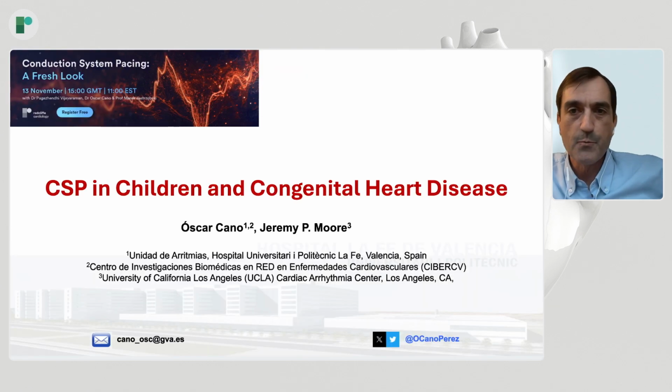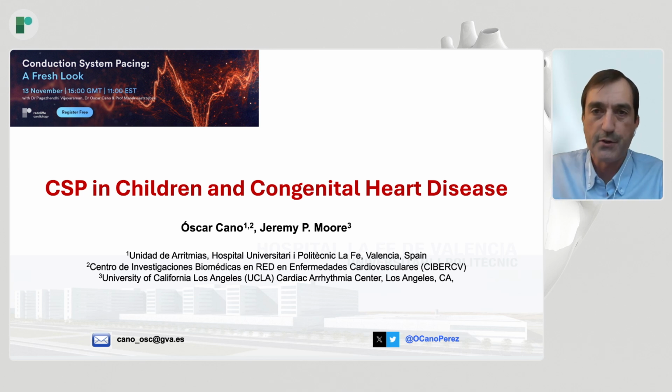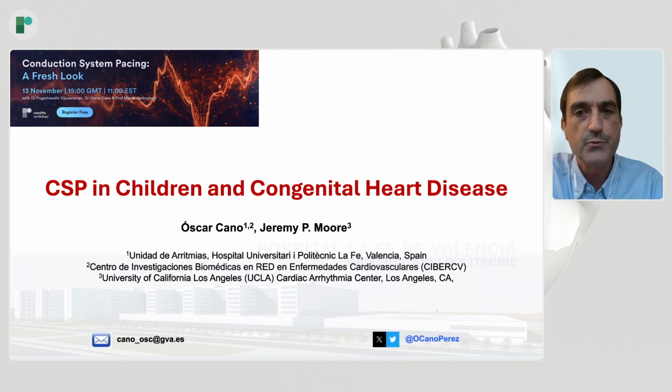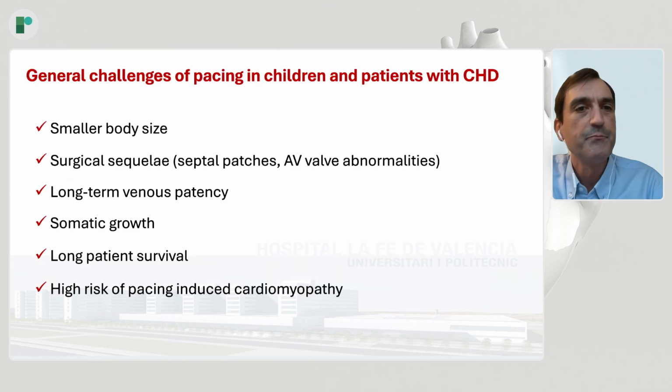So moving now towards a completely different scenario, which is the use of conduction system pacing in children and congenital heart disease. This is actually a challenging scenario where we are going to deal with patients with a smaller body size, with surgical sequelae, with problems with long-term venous patency.